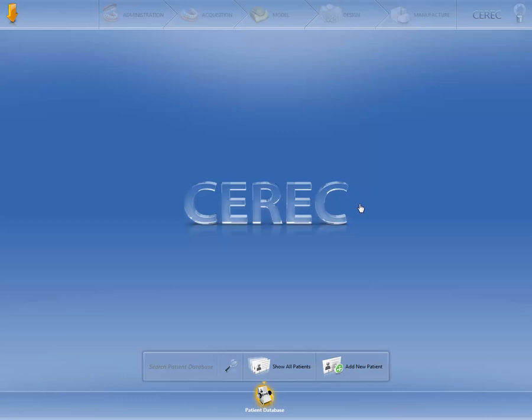First, the start window appears once the CEREC software is opened. If your patient has already been saved in the system, you can search for them by entering the name and then clicking on the magnifying glass. Alternatively, you can also select your patient directly from the database.